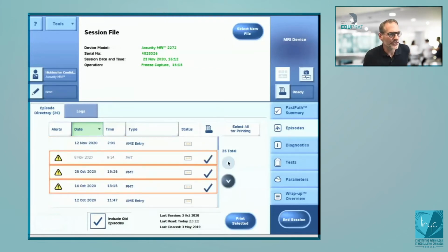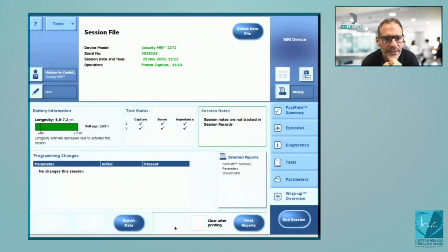There is a question about whether we should delete all the episodes. So remember one thing. If a patient comes with episodes, can you show us how to do it? If you want to wrap up, and then here it's not clear, but you can delete the episodes.